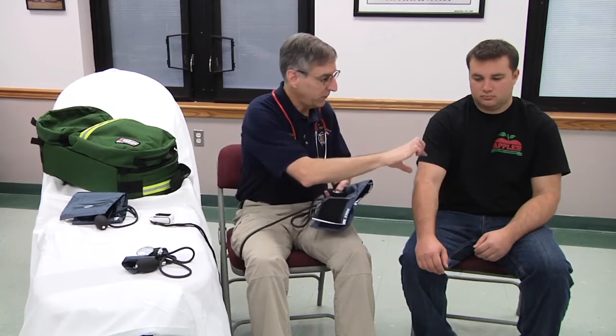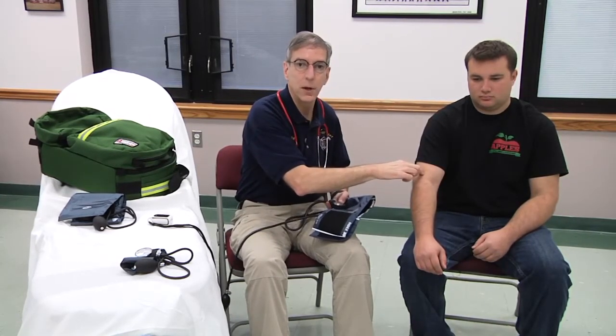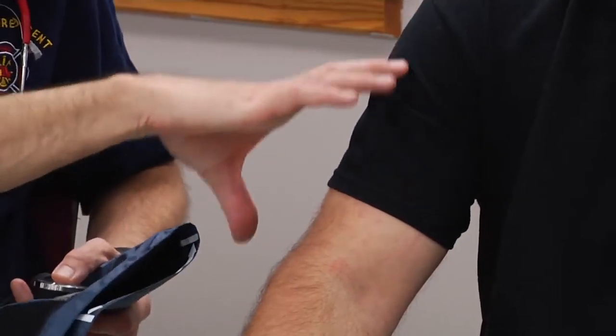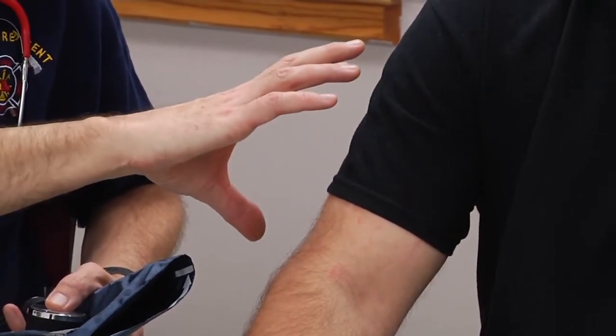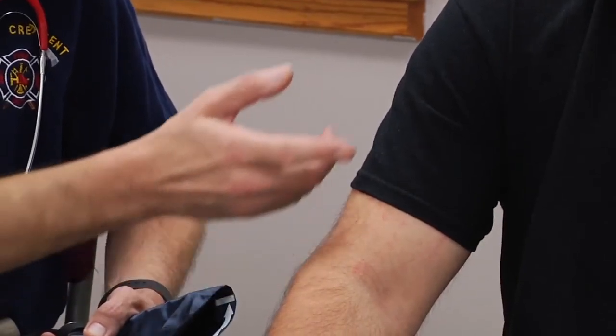None of us carry a tape measure, but if you look at the cuff itself, the bladder is sized according to the size of the actual cuff. If you choose a cuff that covers two-thirds of the patient's extremity that you're measuring — so in this case, measuring blood pressure in the upper arm — you'd want a cuff that covers two-thirds of the distance between the elbow and the shoulder. So obviously, this pediatric cuff is far too small.